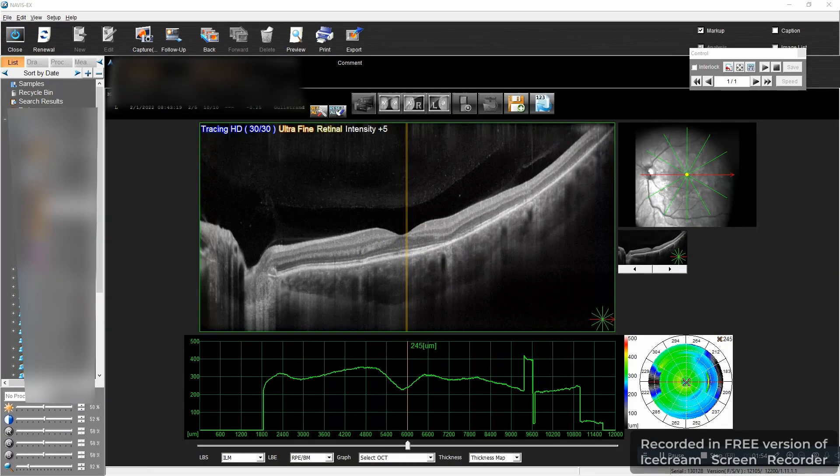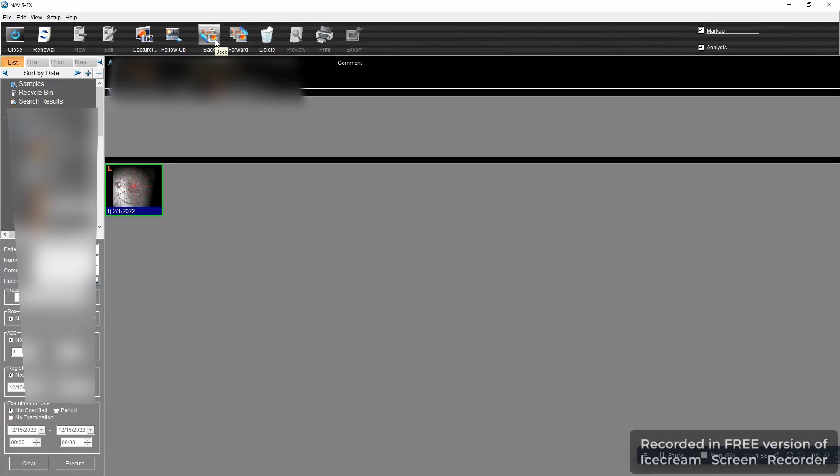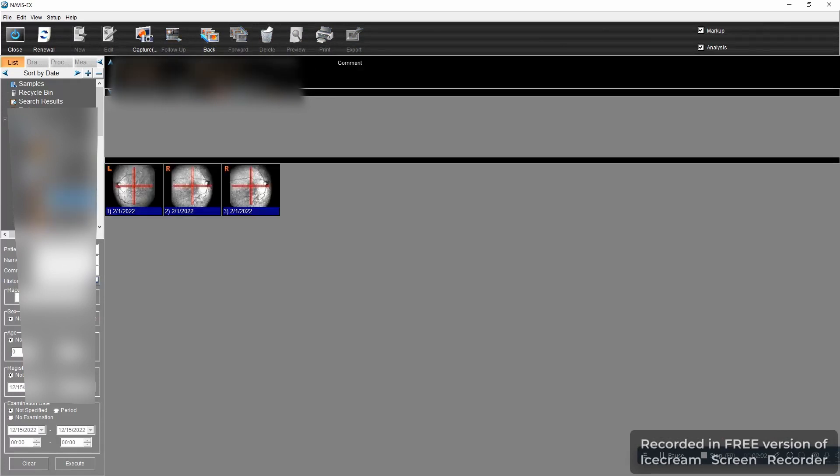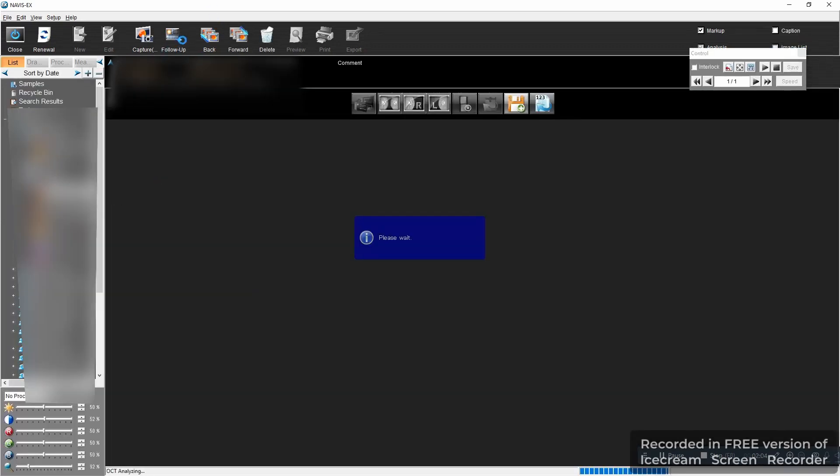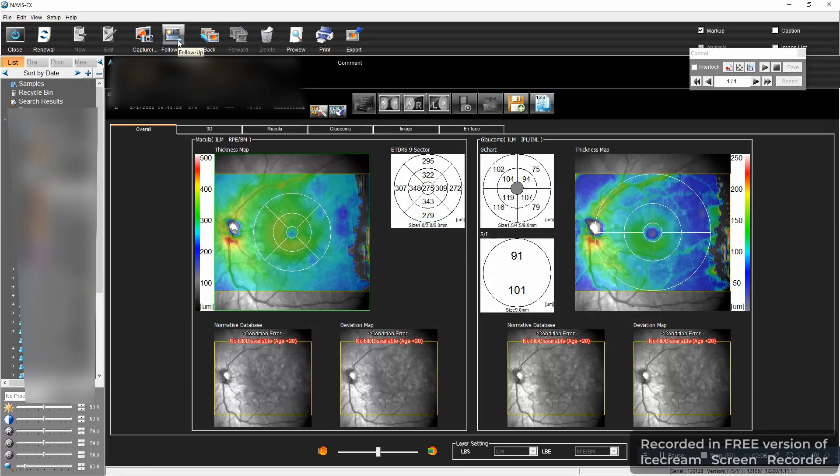Naturally there are multiple types of scans like all the other devices. You have raster, you have cross, you have line scans, you have macular map, but probably macular map is going to be the most often used.